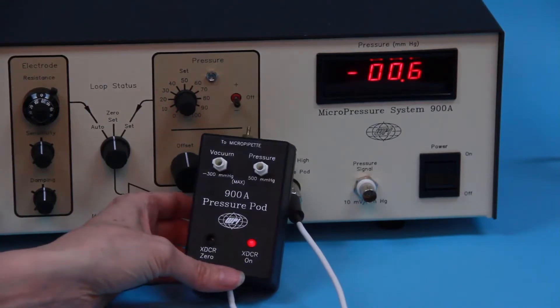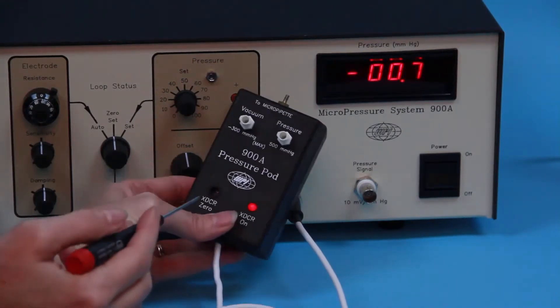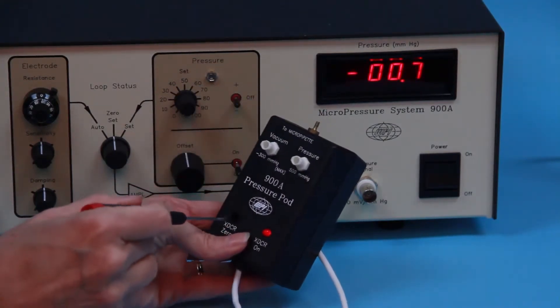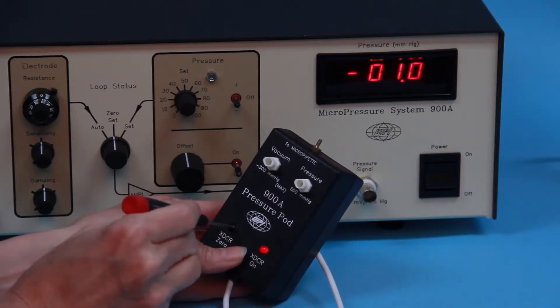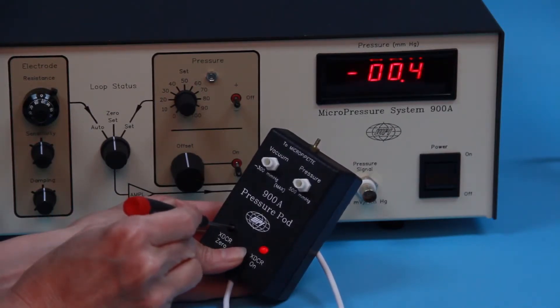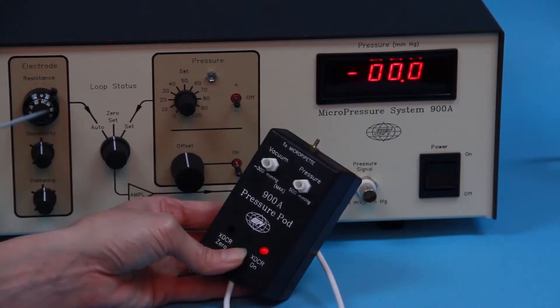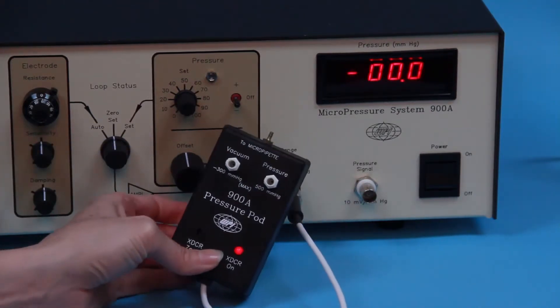Now we can zero the pressure pod. Do not apply any pressure or vacuum to the pressure pod. Insert a screwdriver into the recess on the pressure pod marked XDCR0 and turn clockwise or counterclockwise until the digital meter on the 900A reads 0.0 millimeters of mercury.